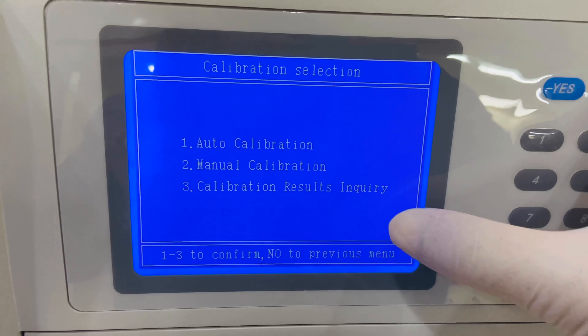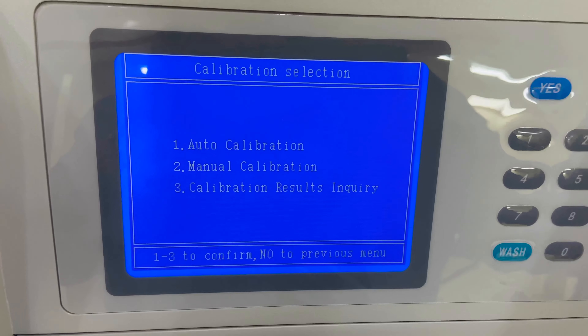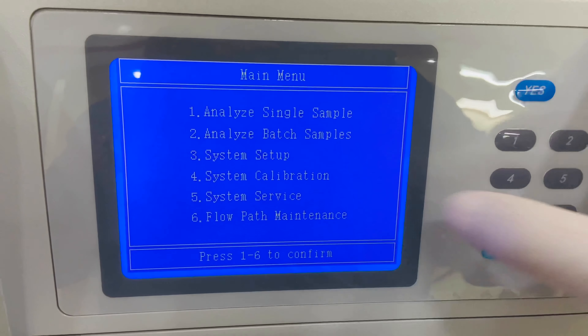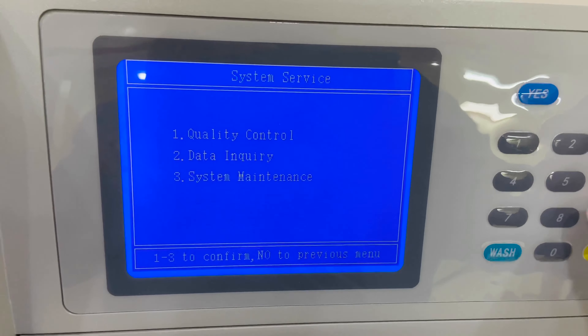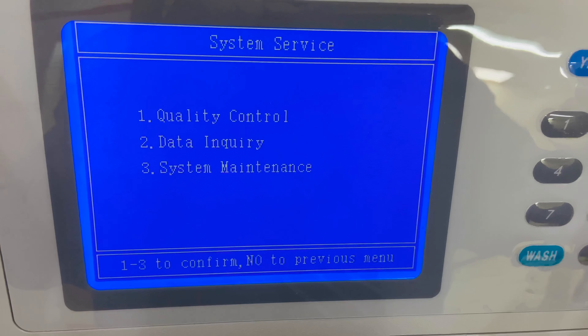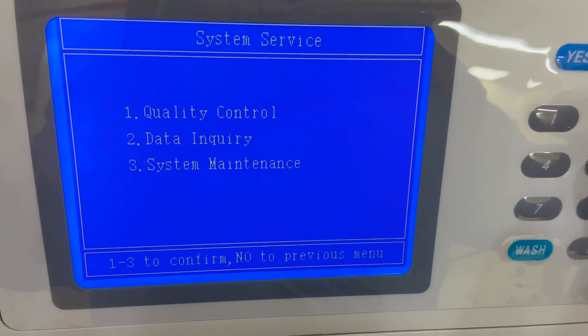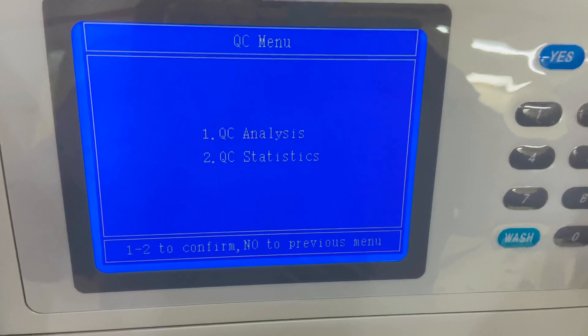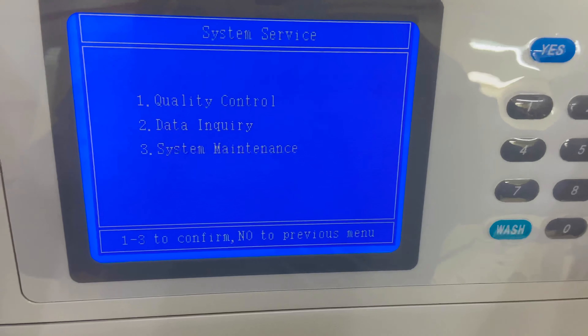Option number three is 'System Setup,' where you can set time, date, print settings, and reagent settings. Option number four is 'System Calibration.' Auto calibration uses the calibrator, while manual calibration lets you adjust the calibration yourself.